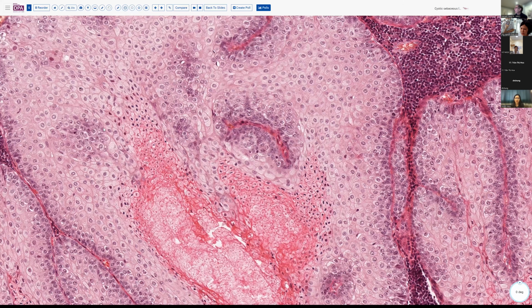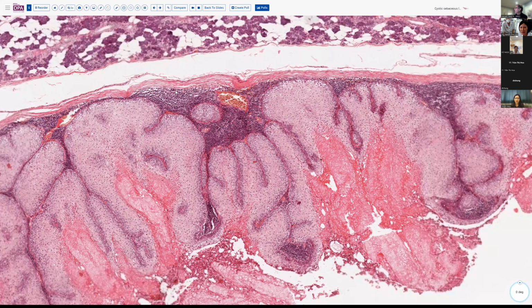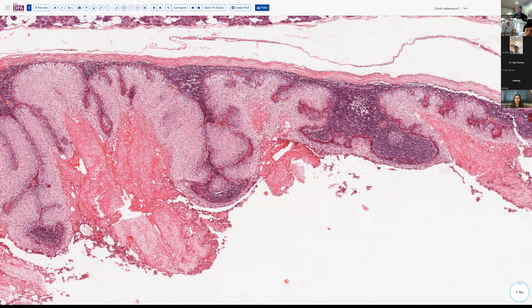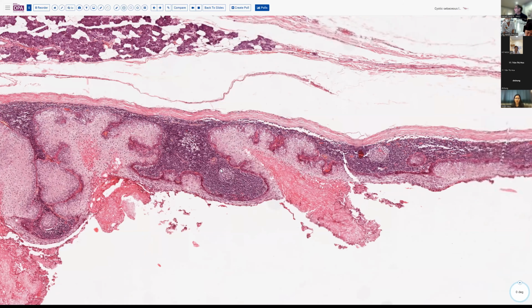But you'll notice that the epithelial cells, uniformly round nuclei, they're very bland appearing. And this lesion also has sort of a lymphoid stroma, so it might even be in the realm or differential for a Warthin's type tumor with sebaceous type differentiation. Just a variety of variations on the theme in the salivary gland that make our tumors here so interesting and diverse.